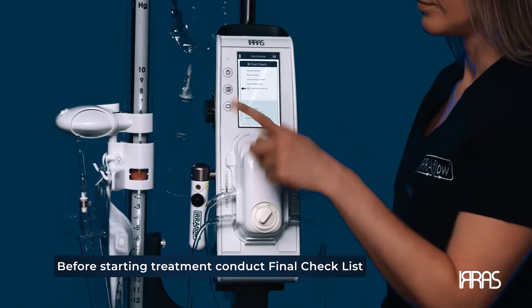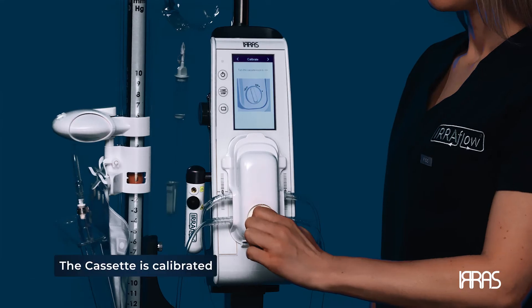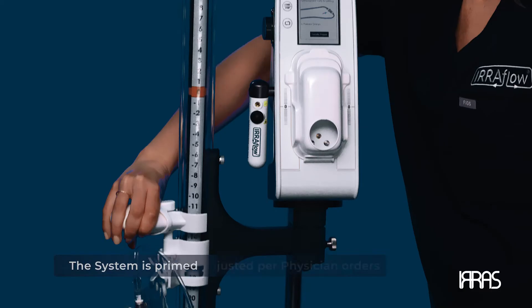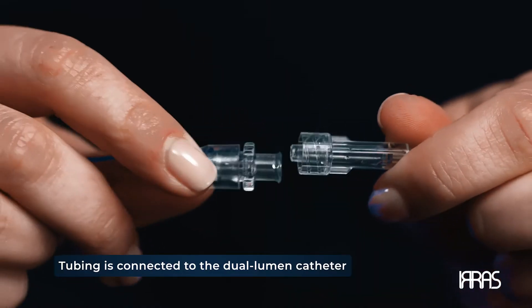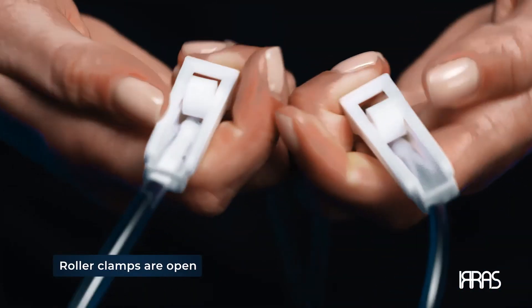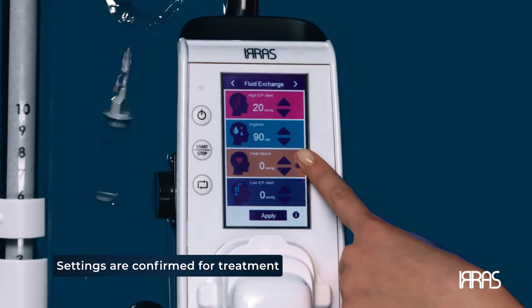Before starting treatment, go through the final checklist to ensure you have successfully completed the following: the cassette is calibrated; the system is primed; the drainage bag height is adjusted per physician orders; the tubing is connected to the dual lumen catheter; roller clamps and catheter tubing clamps are open; and the control unit is level to the patient. The settings are confirmed for treatment.